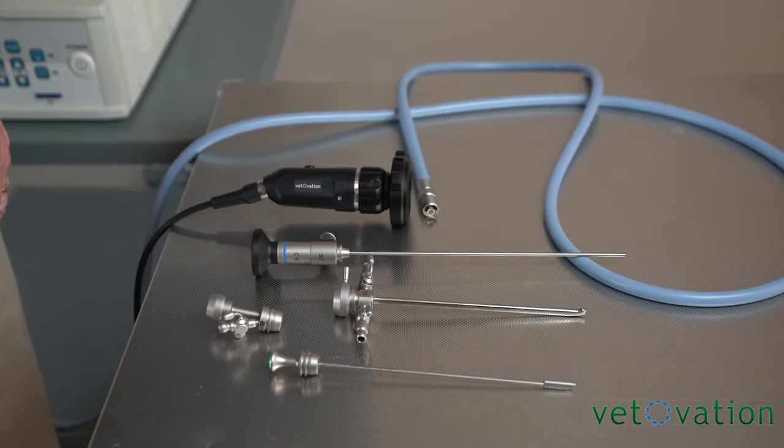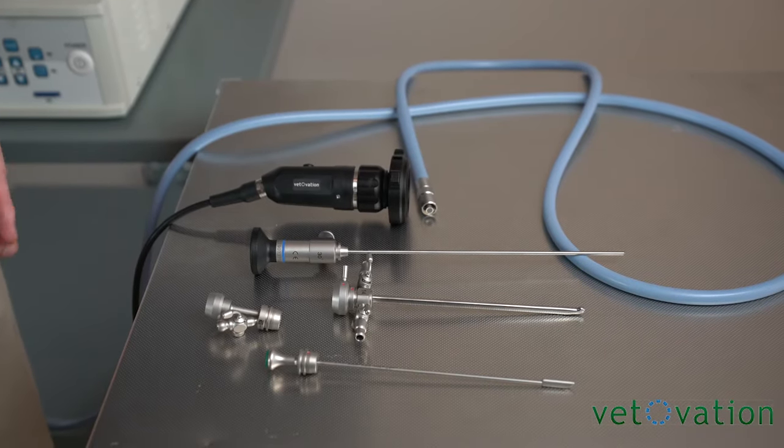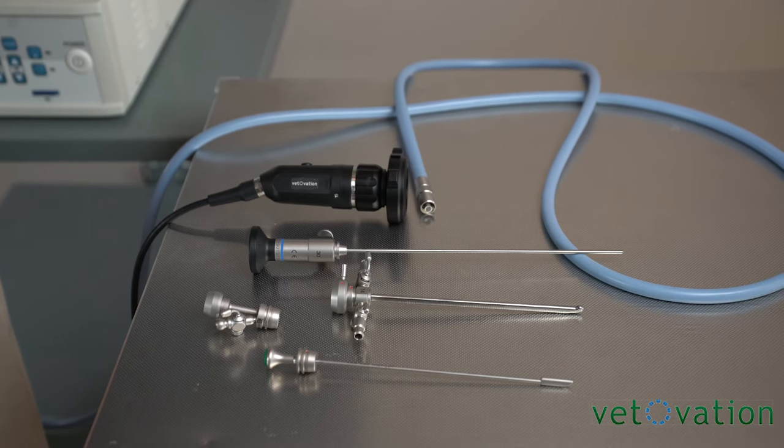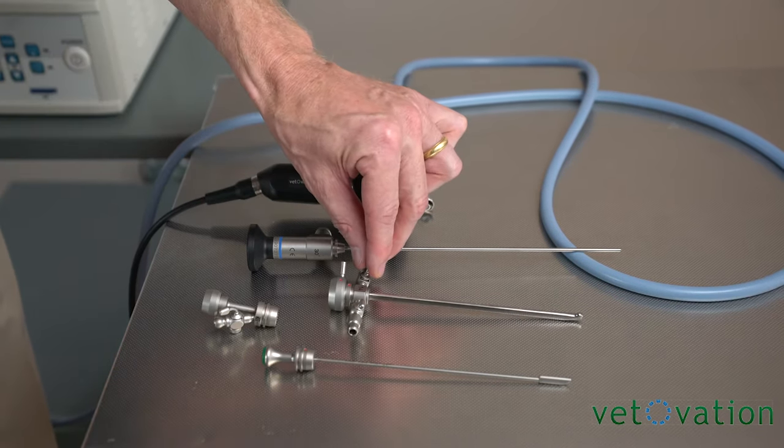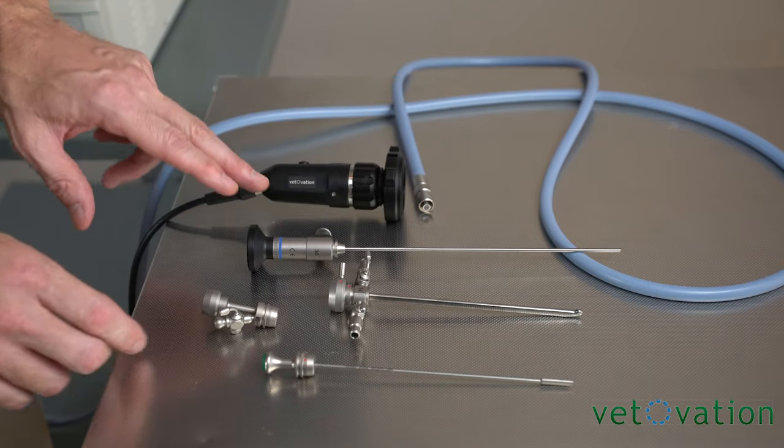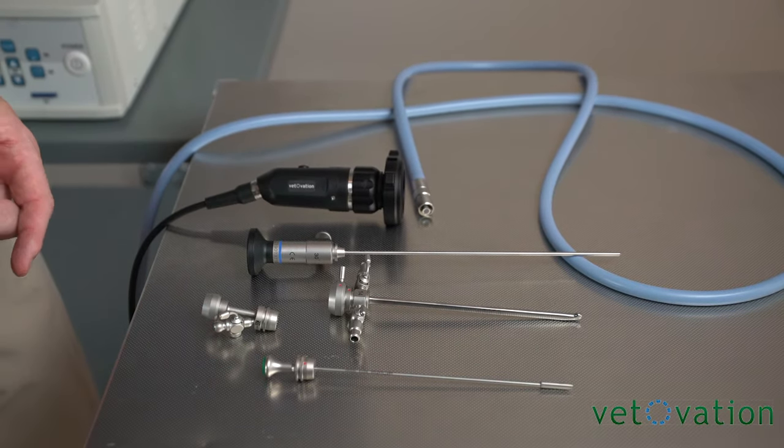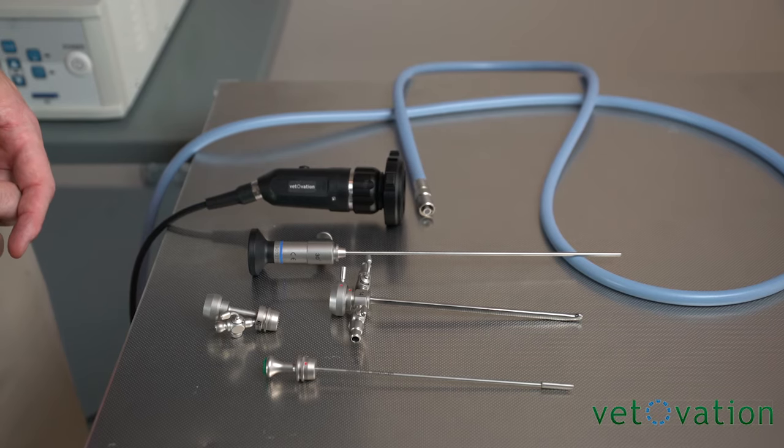The multi-purpose scope is frequently used for rigid rhinoscopy or cystoscopy. The system comes with a shaft, an obturator, a bridge, and a scope that is either available in a zero degree or a 30 degree.